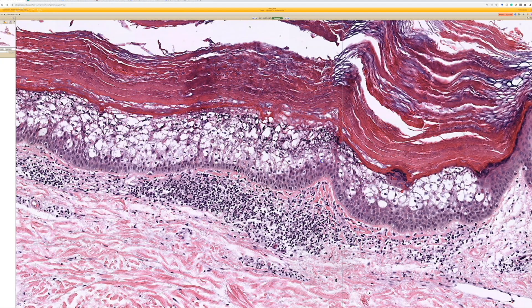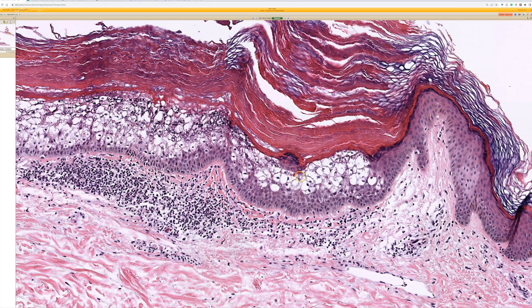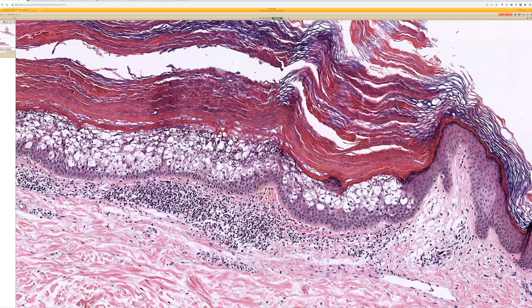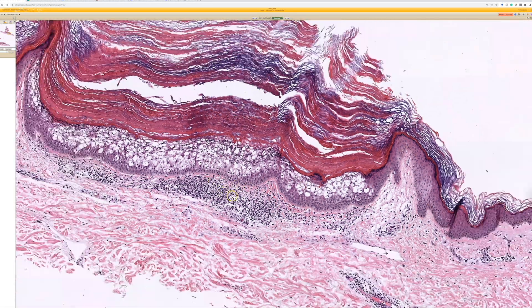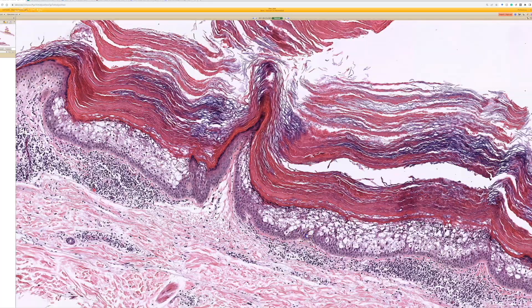Some people are born with this as a form of ichthyosis, which is because of germline mutations in keratin 1 or keratin 10. We also see this as incidental foci, or occasionally we see this where it's clinically noticeable as a solitary lesion.